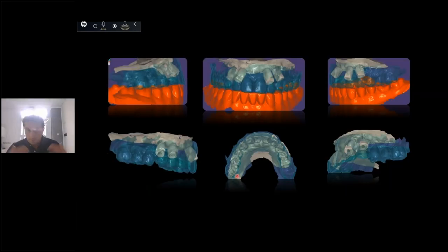Okay. In this patient, I placed four implants in the upper jaw and two implants in the lower jaw. So you can see in the lower jaw our denture, and in the upper jaw I'm making a new overdenture where you have four implants, and I use a bar to join these implants because in the upper jaw I prefer to have four implants without a palate. But it's not important. This is the situation at the end of my therapy.